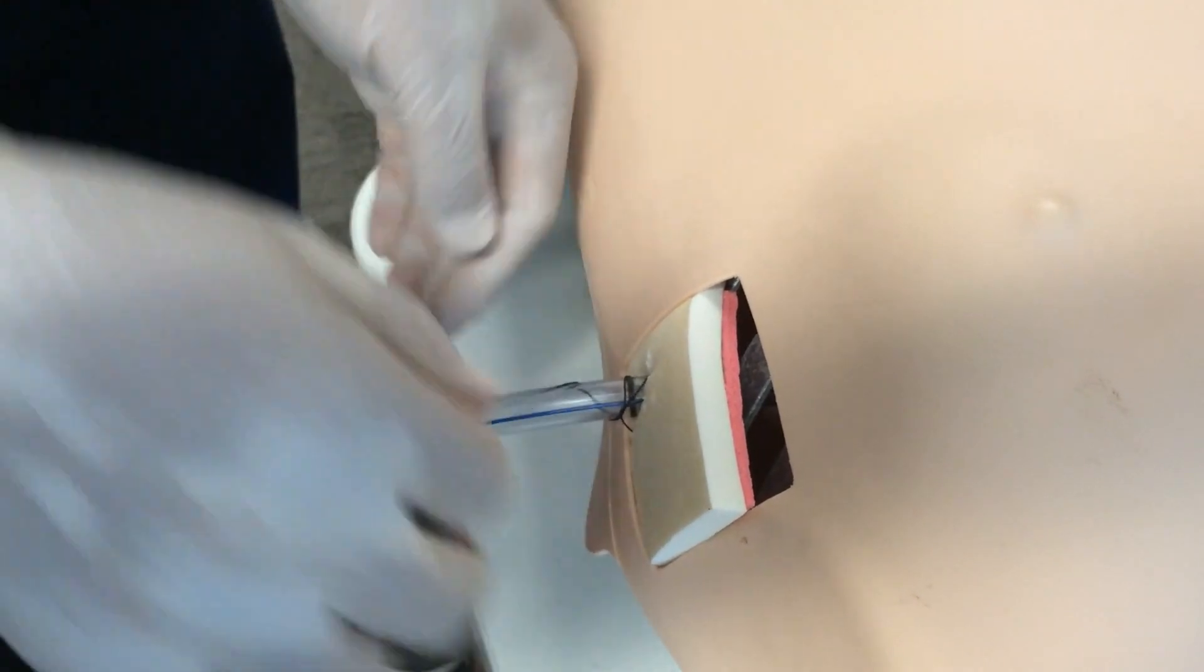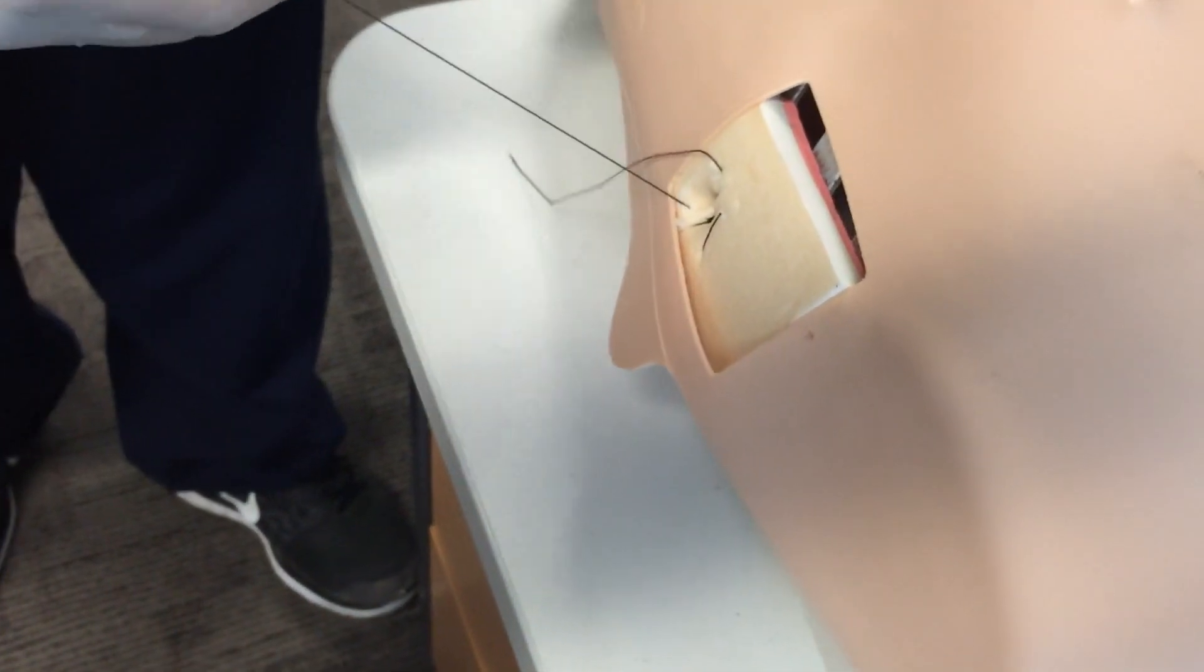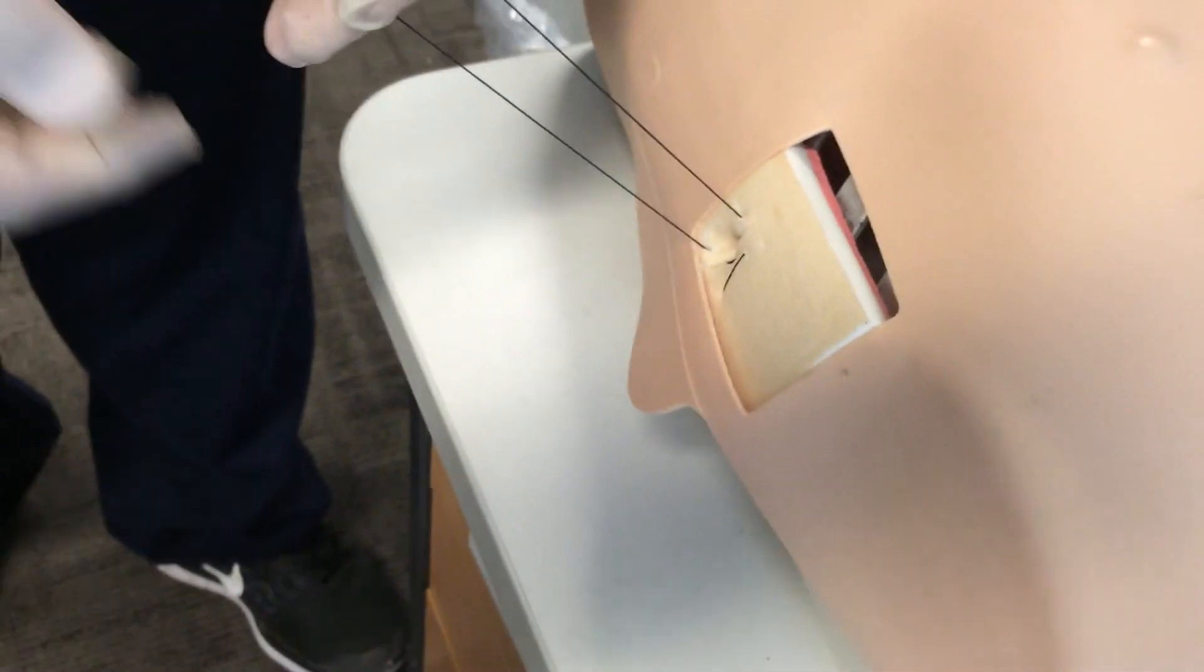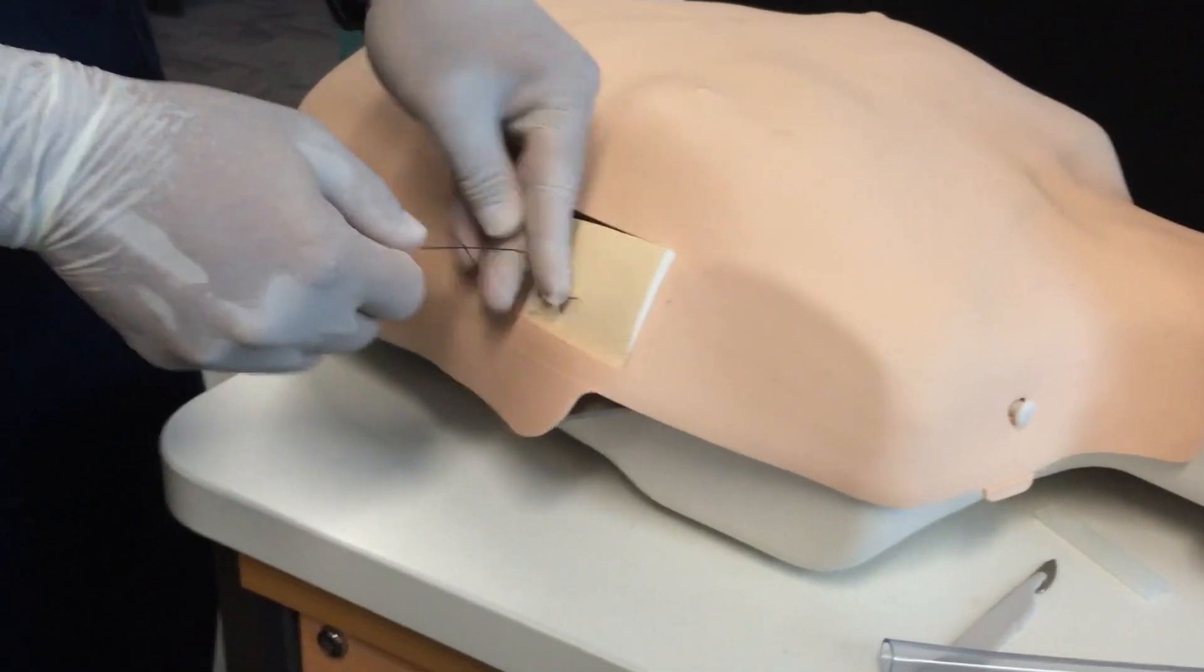Drain comes out. That leaves you with the suture you originally placed in to close the wound up.